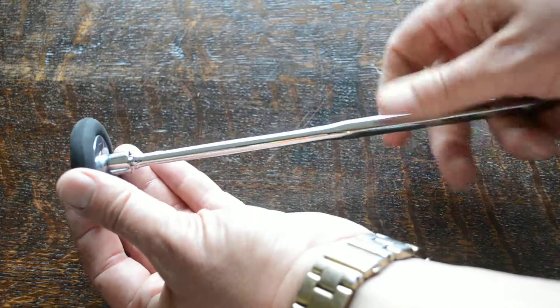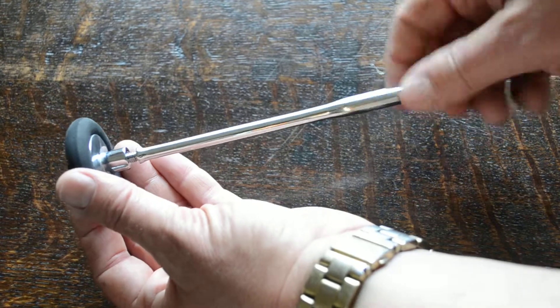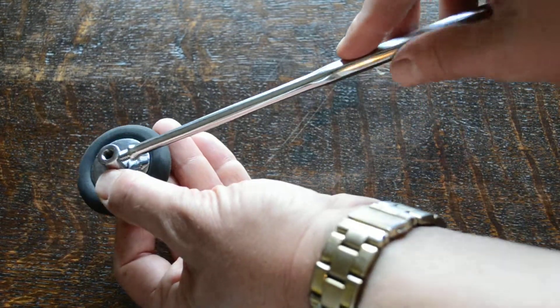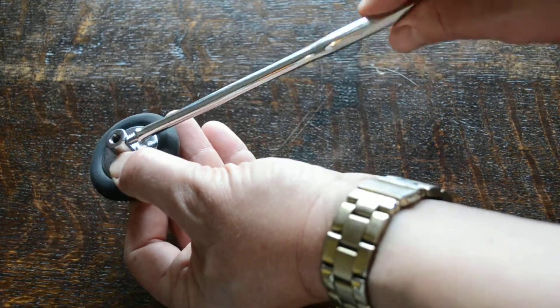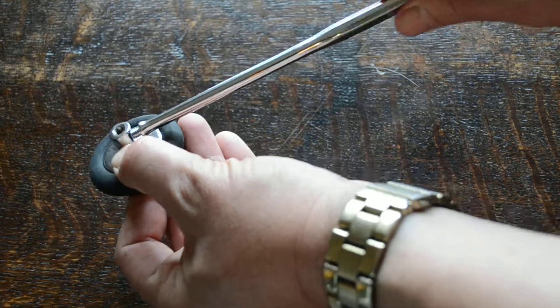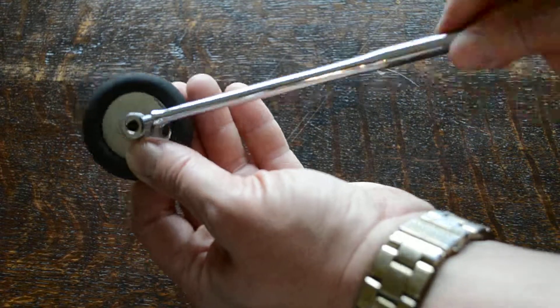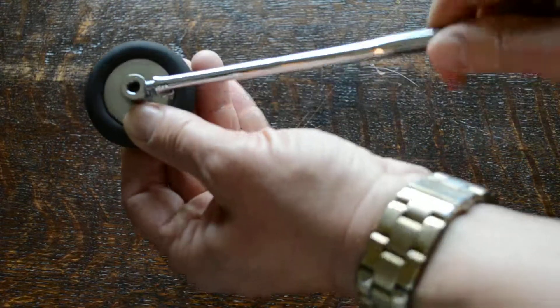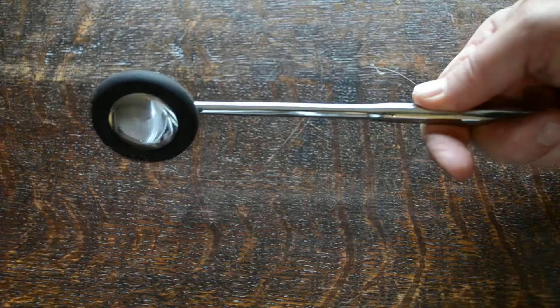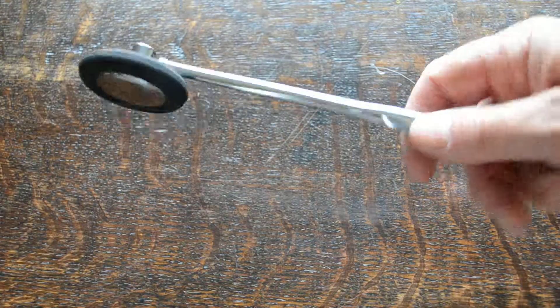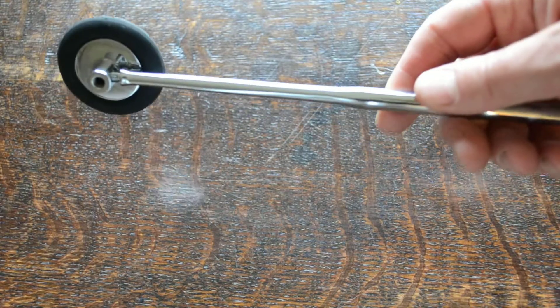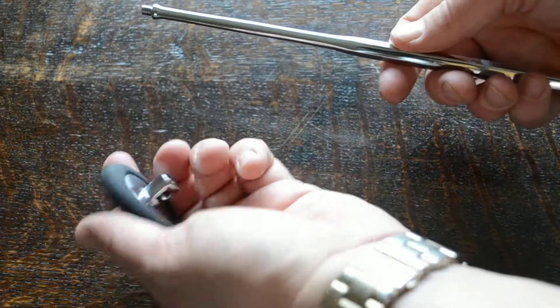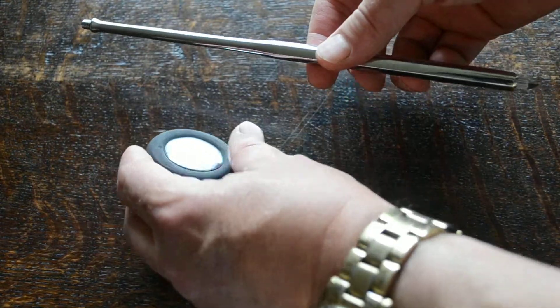If you want to use it in Babinski format, unscrew, reapply the screw fitting on the side fitting and there you've got your standard Babinski reflex hammer setting. So very easy to adjust into the two formats.